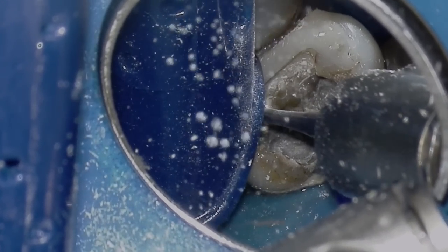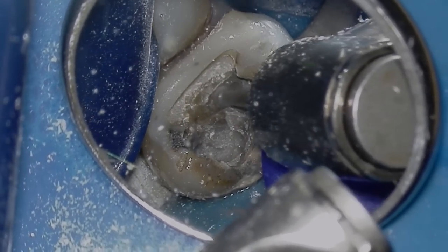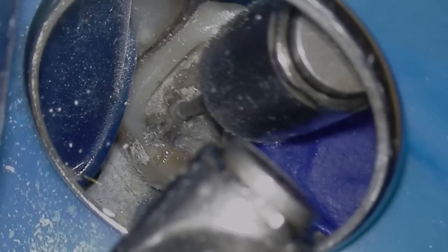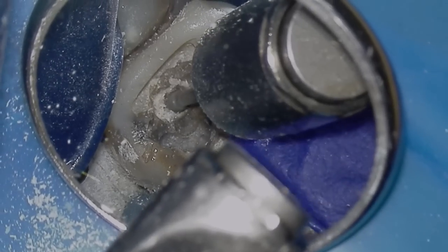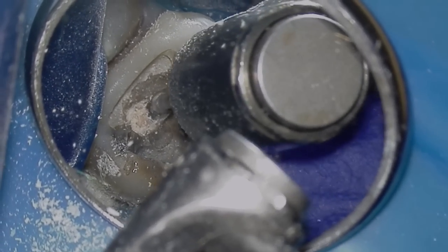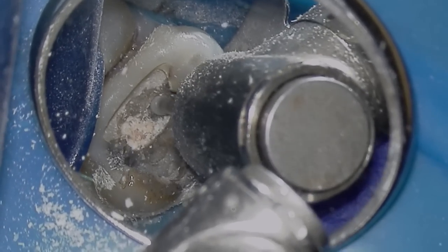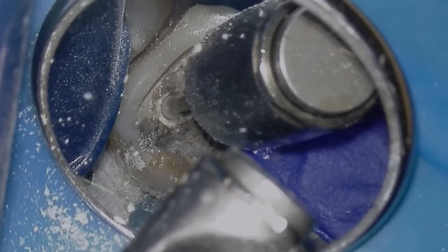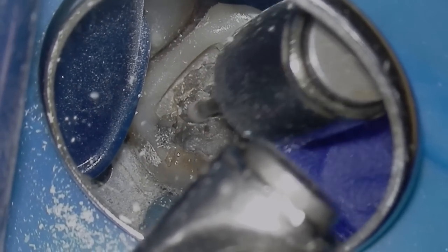I'm using a number four large long surgical burr just to slowly remove dentin to finally find the pulp chamber, and you'll see me enter the pulp chamber right about now. I'm slowly un-roofing the pulp chamber. Normally if it's a large pulp chamber I'll use a non-cutting tip burr called the Endo Z burr, but in cases like this where the pulp chamber is not very large, all it does is burn the dentin and skate around.